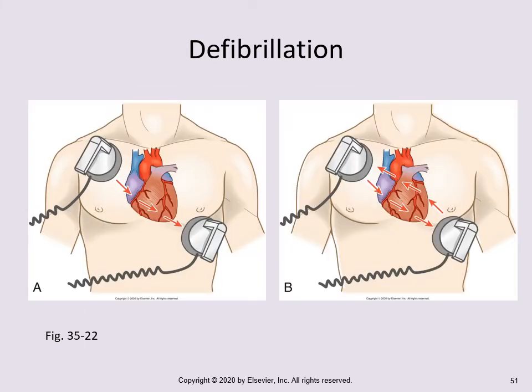Most defibrillators come with monitoring, defibrillating, and transcutaneous pacing capability for the patient. First of all, most of the time the defibrillator is not going to be immediately available, so CPR should be initiated and continued unless you actually have the paddles on the patient and are doing the defibrillation. Once the machine is at the bedside, you're going to turn it on and select the proper amount of energy. More about that when we talk about synchronized cardioversion.